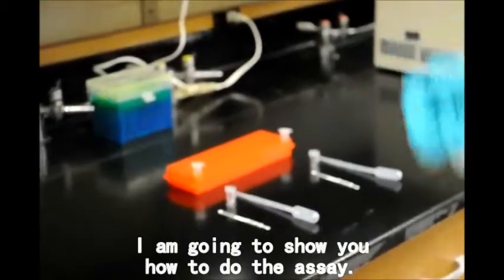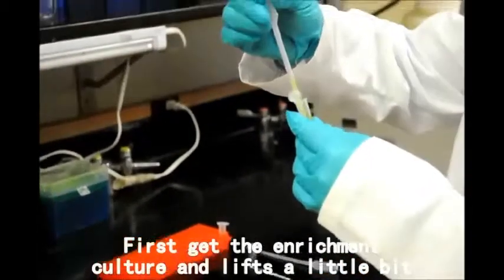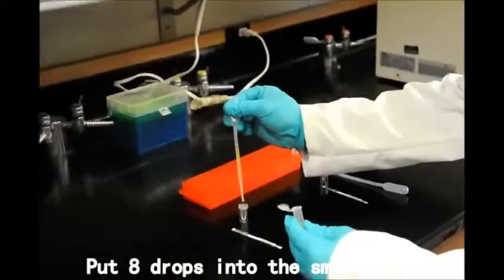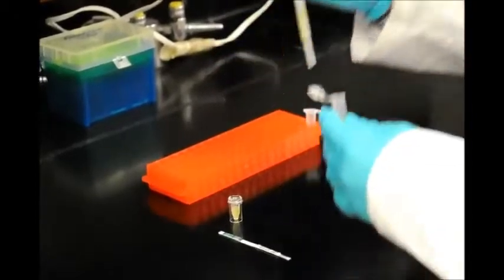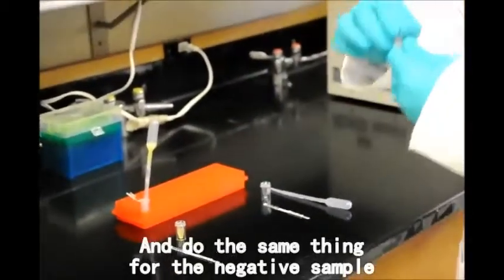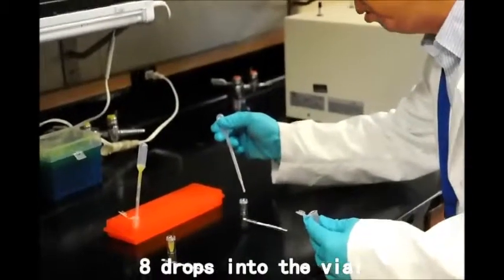I'm going to show you how to do the assay. We get the enrichment culture and mix it a little bit, then put a drop into the small vial. We will do the same thing for the negative sample and put a drop into the vial.